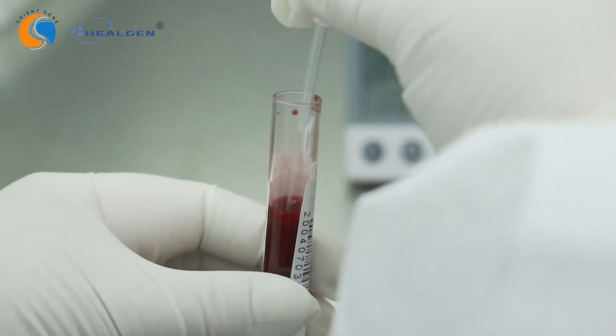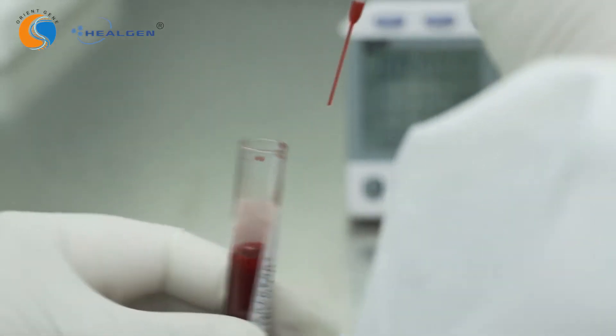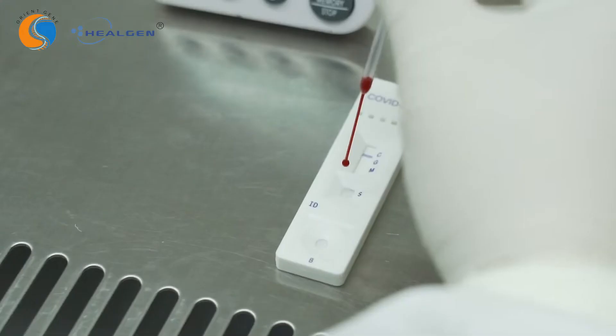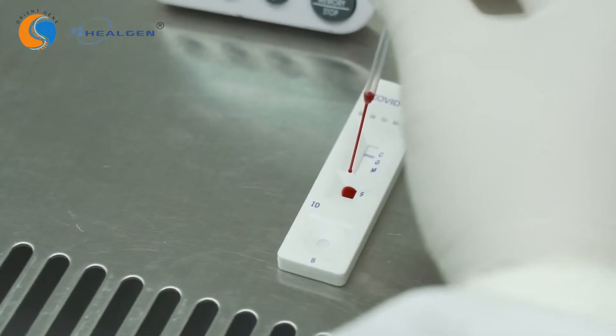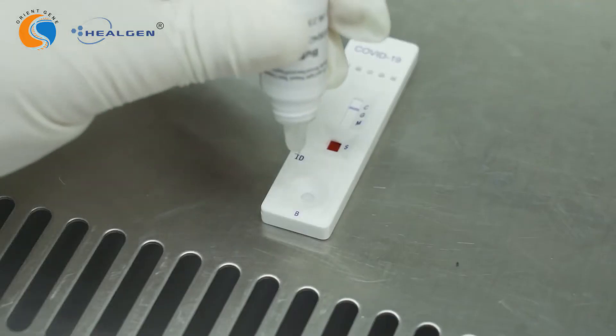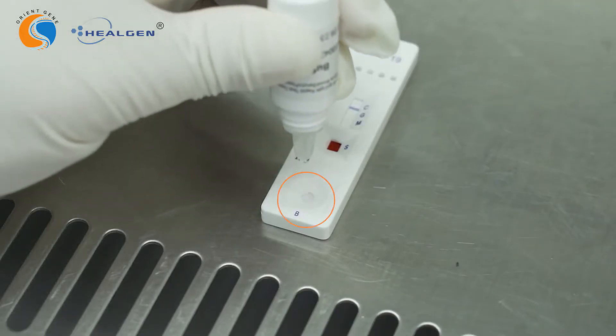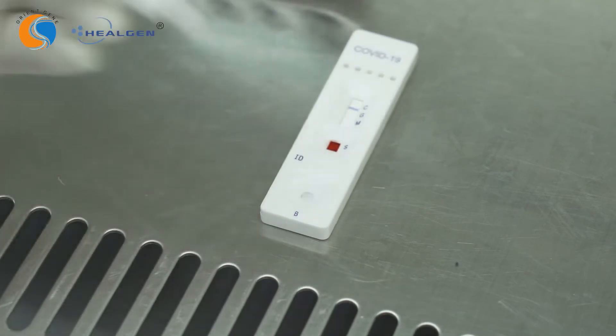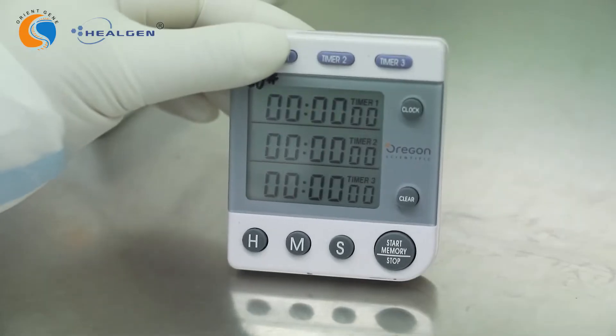For whole blood specimen, draw the specimen into the dropper. Hold the dropper vertically and transfer one drop of whole blood to the sample well. Then add two drops of buffer to the buffer well, immediately after. Start the timer.